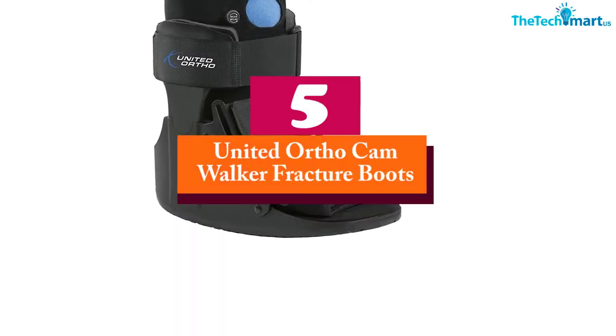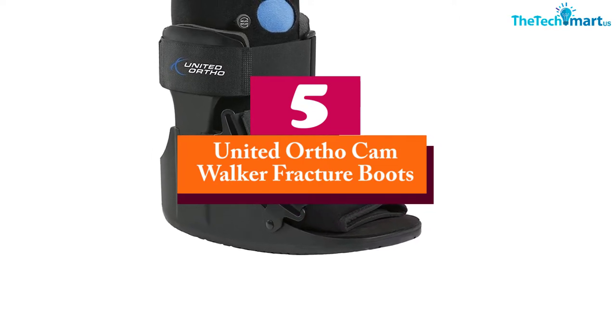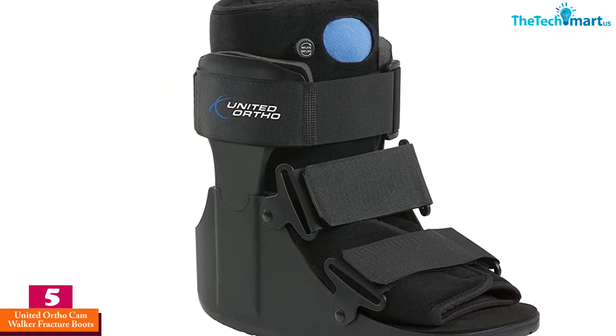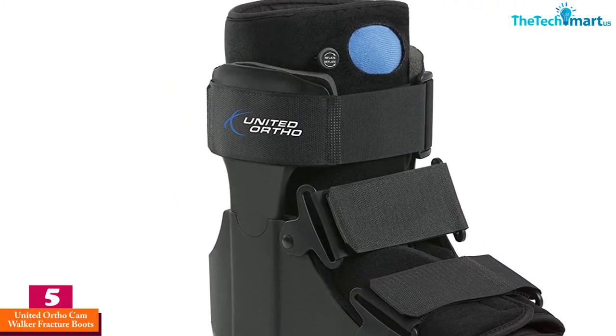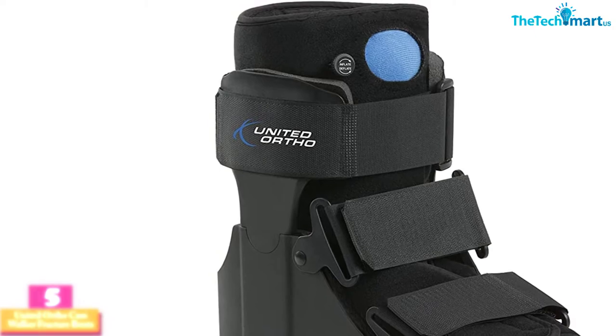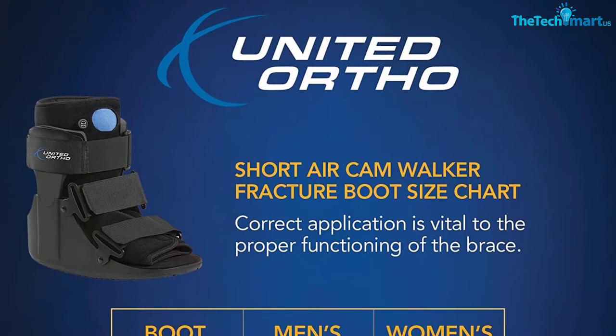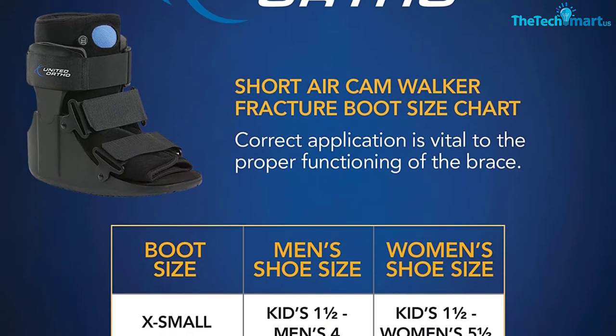Starting at number 5, we have the United Ortho Cam Walker Fracture Boots. The cam walker boot comes with a shock-absorbing insole to provide reduced impact while stepping. This leg brace also has a rocker sole to offer a natural gait, so you can walk continuously without stressing your injured leg.